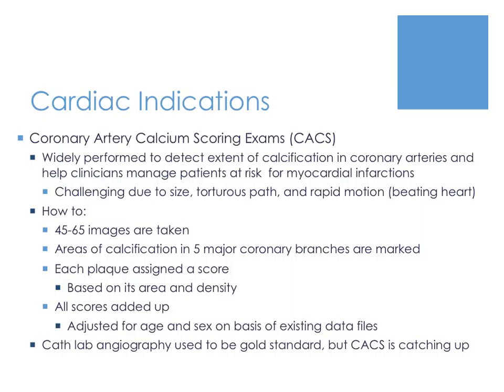Coronary arteries are very challenging to image due to their small size, their tortuous course, and pronounced rapid motion from the beating heart. Cath lab angiography used to be the gold standard for imaging the coronary arteries, but now CT is actually a close second due to the non-invasive manner that it uses.